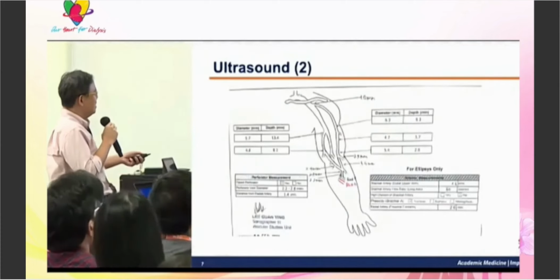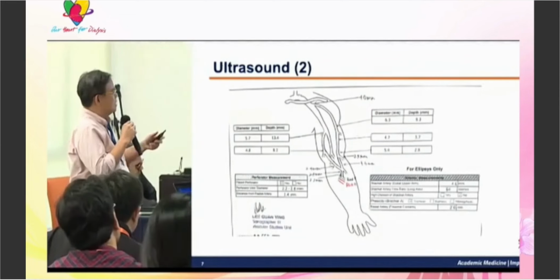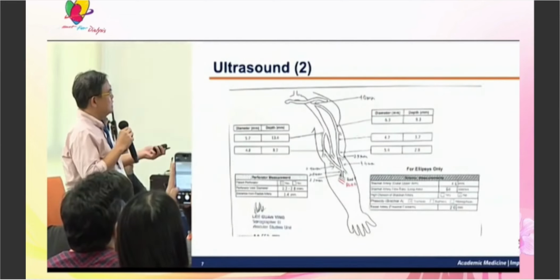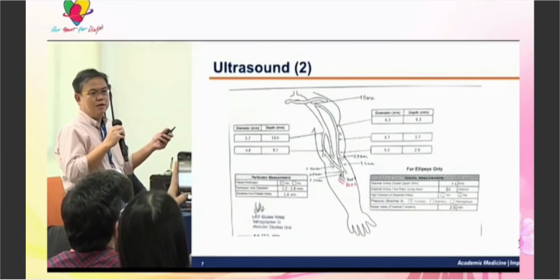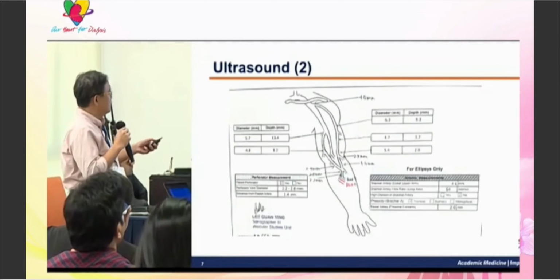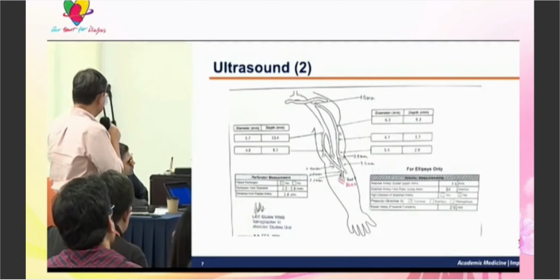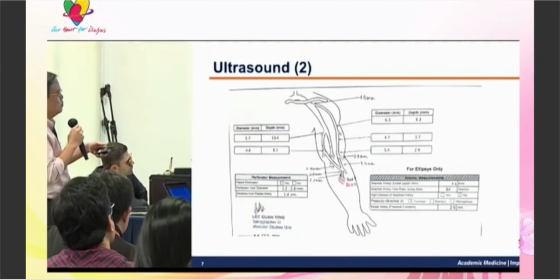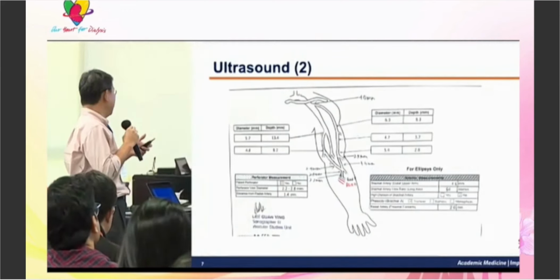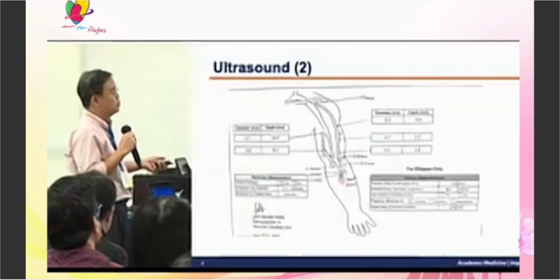Now, on the other hand, this is a perfect patient, a very nice, juicy cephalic vein that's about the same size as the basilic vein. And it's superficial enough, 2.8 mm, 3.7 mm at the lower and the middle part of the upper arm. And the distance from the radial artery is 1.4 mm. So technically, this guy, as Robert has said, will be eligible for both Ellipsys and the WavelinQ system. But because he has a very good access vein from the radial artery and radial vein, we decided to do a WavelinQ for him.